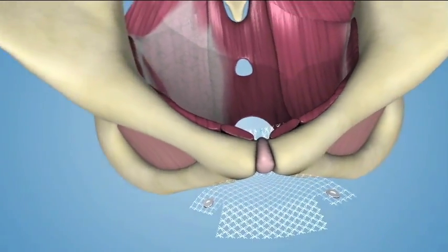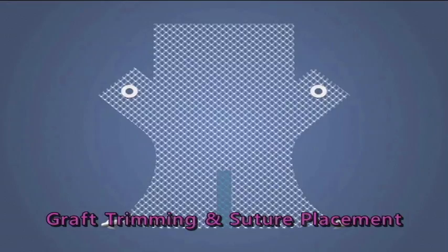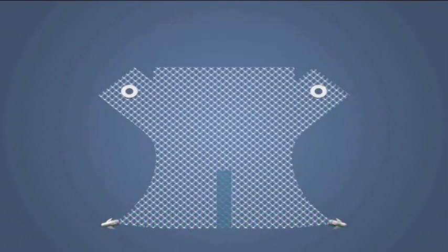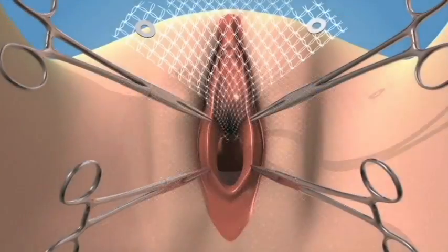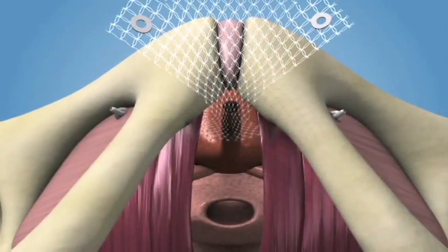Affix the center of the graft to the bladder neck with sutures. Graft trimming and suture placement. Trim the apical end of the body to the desired length based on the patient's anatomy. Place two or more delayed absorbable sutures at the vaginal apex for later attachment to the graft.